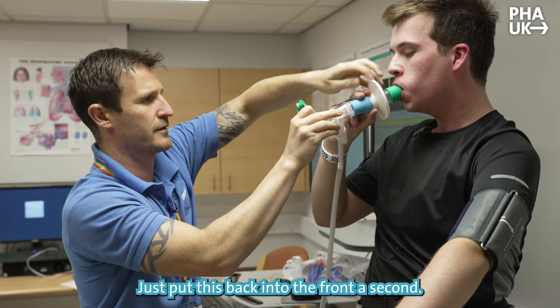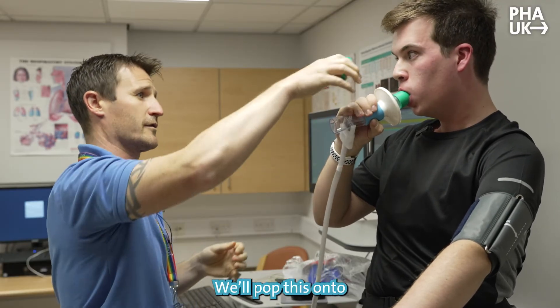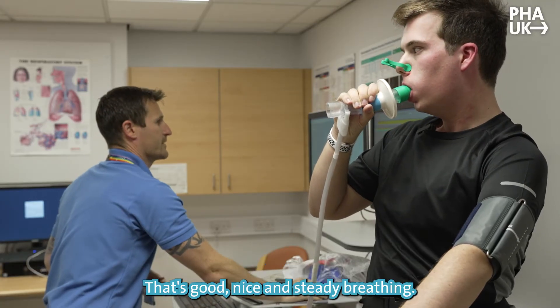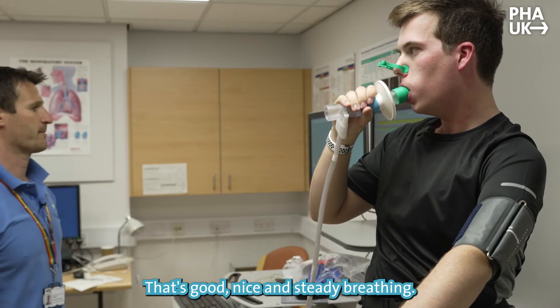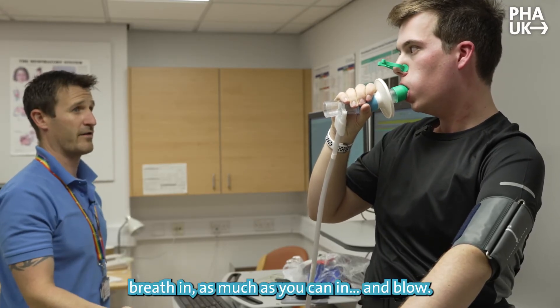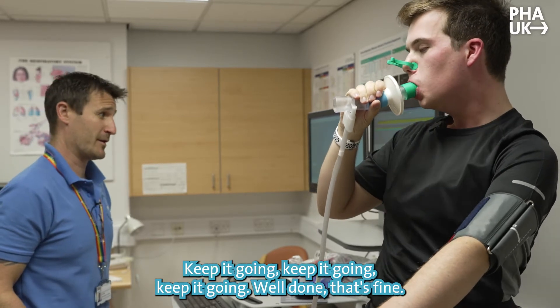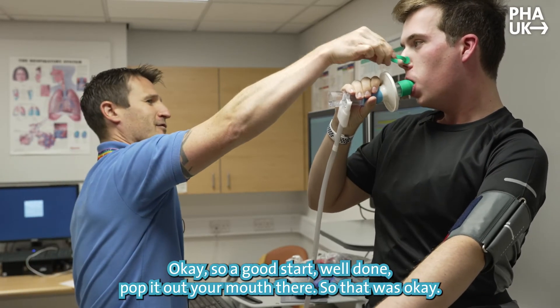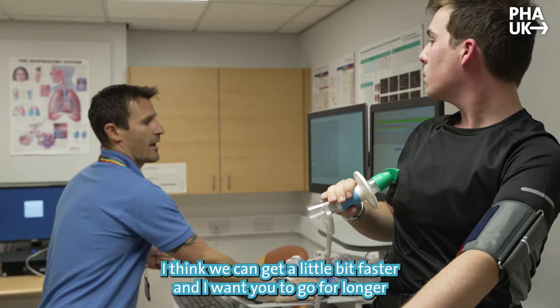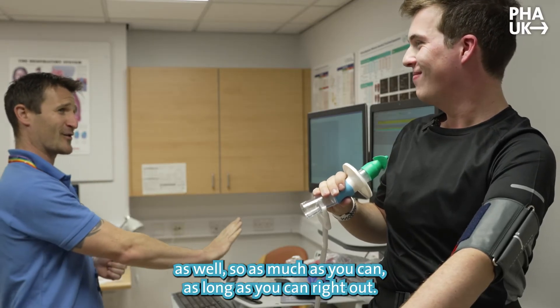I'm just going to plug this back in. Okay, I'm going to pop this onto your nose — breathe normally, just in and out, nice and relaxed. Then I want you to take a really big deep breath in as much as you can, and blow — keep it going, keep it going, and relax. That's fine, good start, well done. I think we can get a little bit faster, and I want you to go longer as well, as much as you can, all the way out. Really blast it as fast as you can at the beginning.